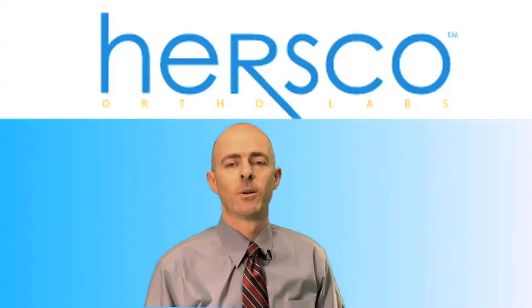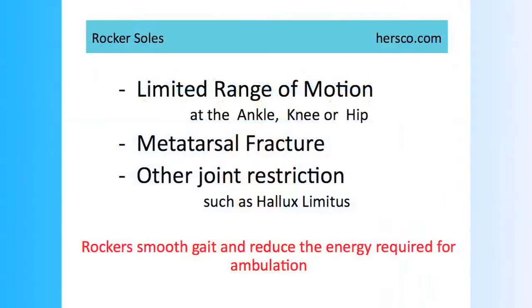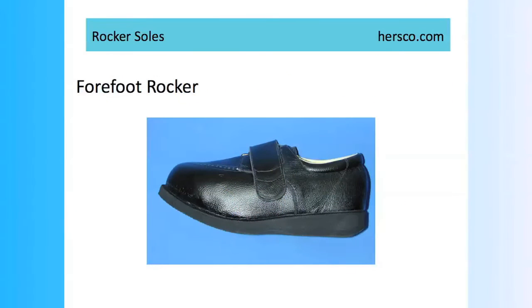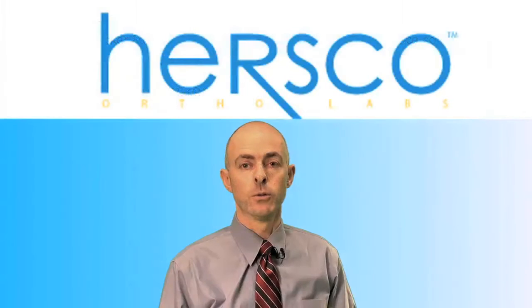We're all very familiar with rocker soles as an external addition to the shoe, and these are very helpful in cases where a patient has no motion at the ankle joint, perhaps has a metatarsal fracture, or has some form of limited motion such as hallux limitus. The addition of a rocker allows the patient to ambulate more smoothly and can be used specifically to prevent flexion at critical joints. There are many styles of rocker sole. They can include forefoot rockers, heel rockers or rollers as they're sometimes referred to, and cam rockers where you get a smooth rocking motion from the heel straight through to the toe.